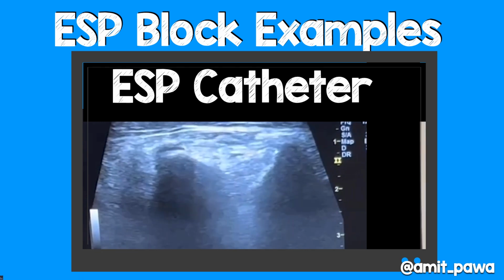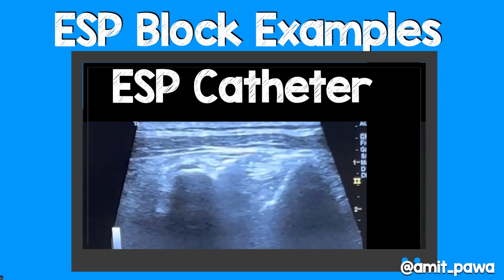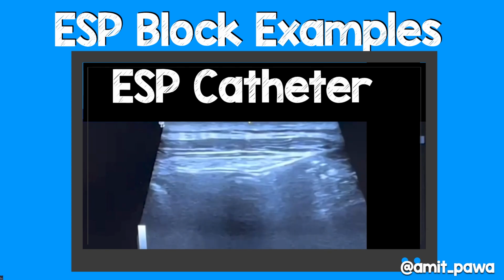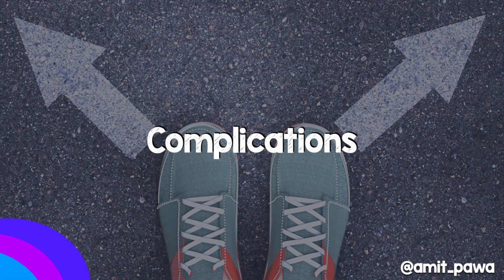As we're injecting local anaesthetic, we're aiming to lift that muscle up, and now you're going to see a catheter coming up out of that needle. There's a catheter just about to emerge now, and now you can actually scan that catheter in long axis and identify its endpoint. So we've talked about the anatomy, the sonoanatomy, and some technique issues in terms of how to get your best options.